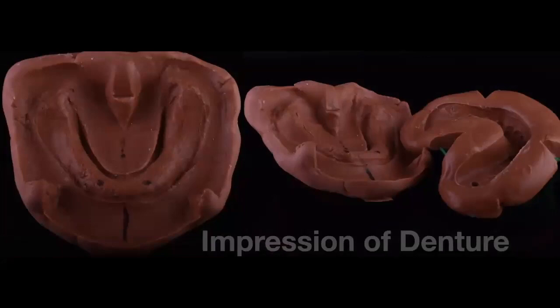So what we're going to do now is make an impression of the intaglio surface of that denture and of the tooth side of the denture. And what you're seeing here on the left-hand side is the intaglio surface impression using PVS directly onto the patient's existing denture. Then we have the tooth side of the denture impression over here. And you can see that we've created some notches here where these two will connect. They will connect in a very specific way.